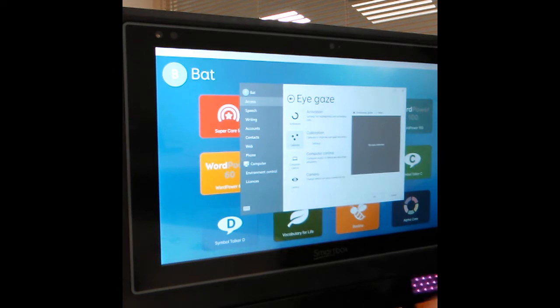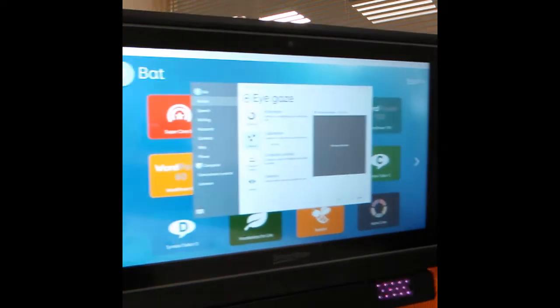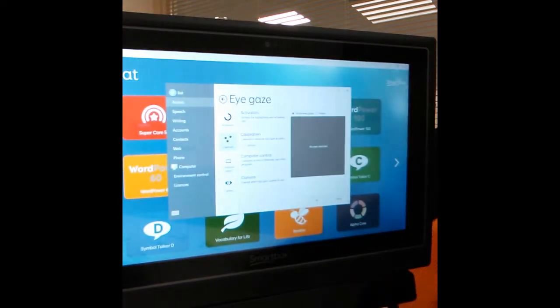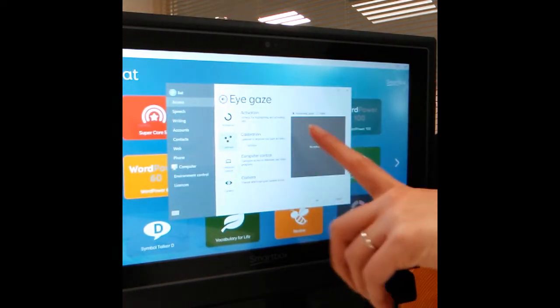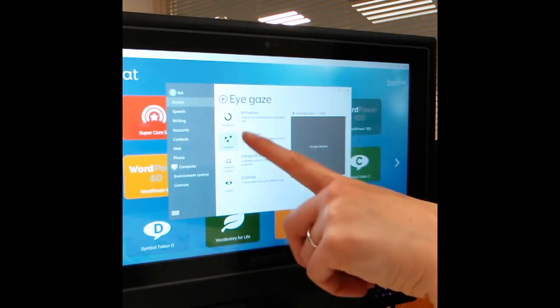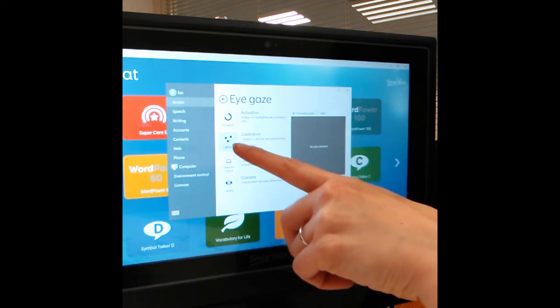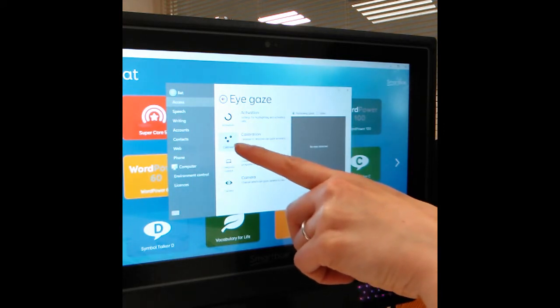What we then get is a little menu. The main thing that we need to do is to check the calibration.